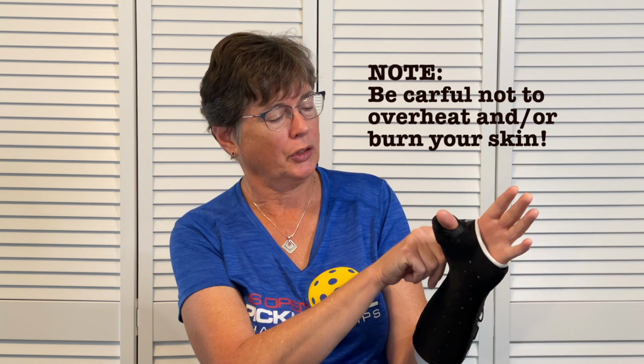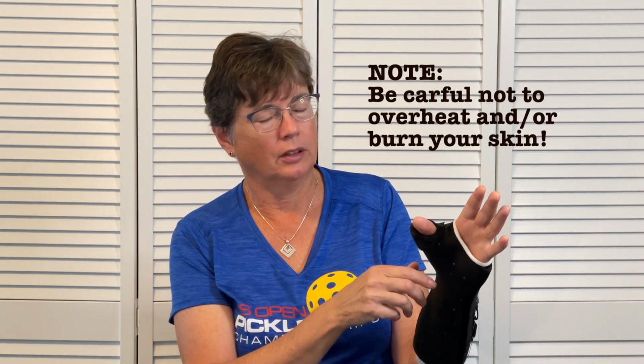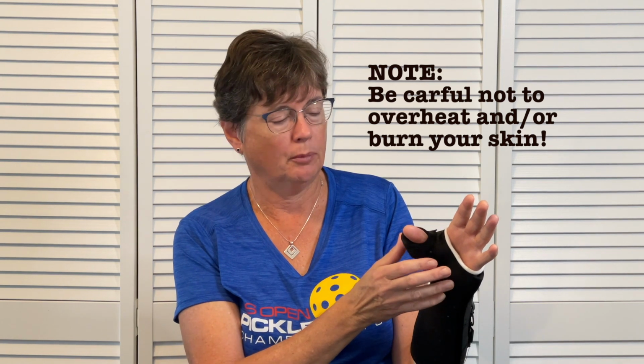So what I did is I took a hairdryer and I heated up just this portion of the cast on a warm setting for about 5 minutes, and then gently bent it, just holding it with my hand, and held it in position for another 5 minutes. And it helped put the angle at such where I can now touch the tip of my thumb, which makes grabbing something like paper a lot easier.